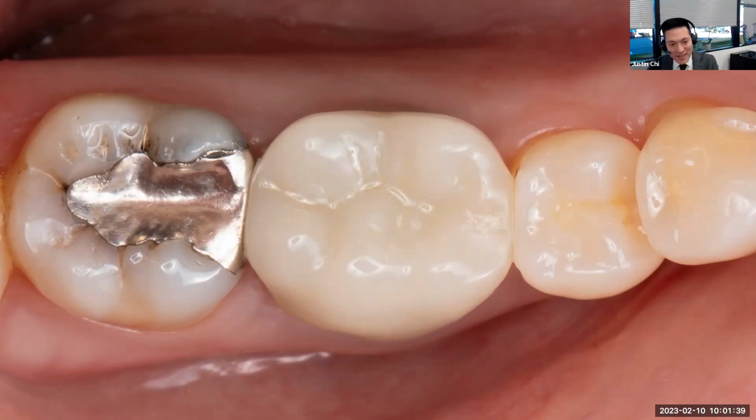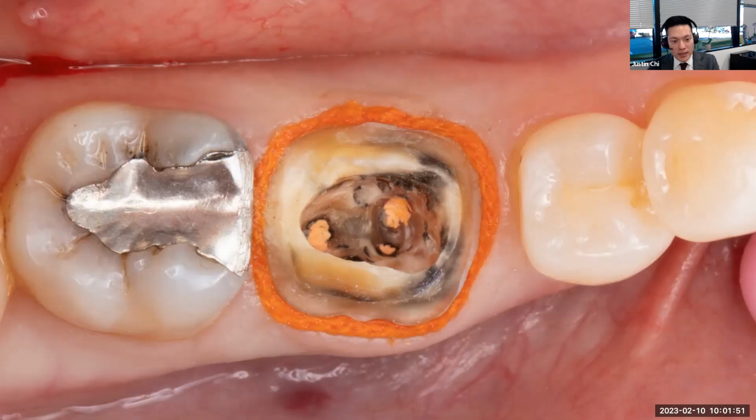All right. So this case here, this is number 30. Another lower molar. Patient had an existing all ceramic restoration. It's not seen here, but the margin of the lingual actually chipped off. So we prepared this. It is endo treated. Notice the size 2 cord placed just below the margin. I don't want to bury that. We want to keep that relatively high because we're looking for that lateral displacement of the tissue.